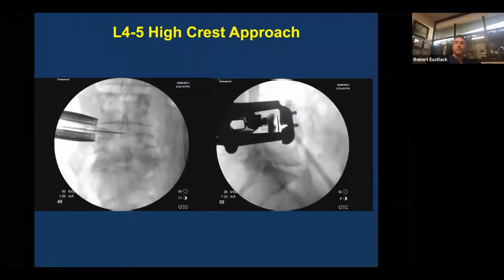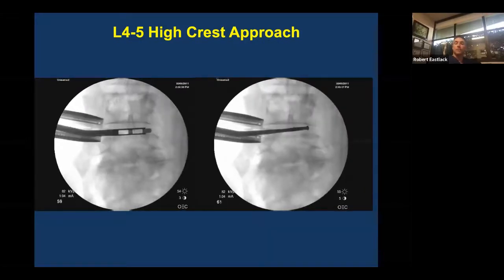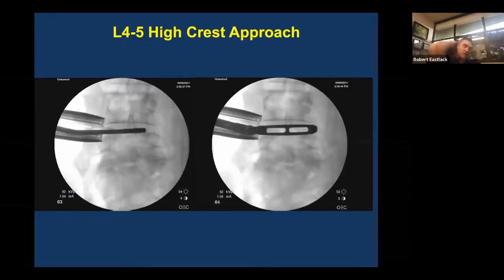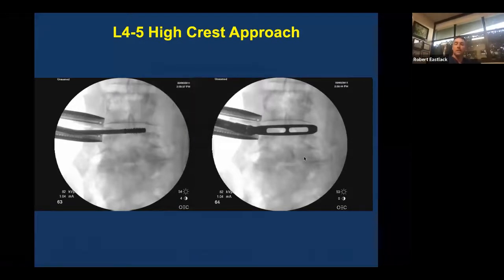That means Cobb first — you can see there a box cutter as well, but I tend not to use that very often. I mainly use the Cobb to debulk and then trial. Once you've trialed, you give the tech your sizes and they start getting your cage ready, and then you can finalize your end plate preparation as you see on the left.